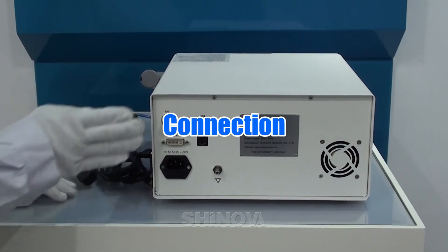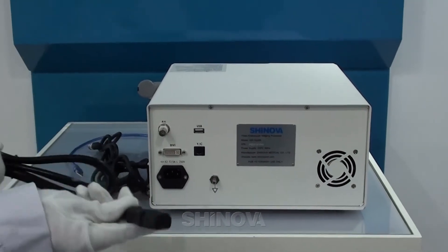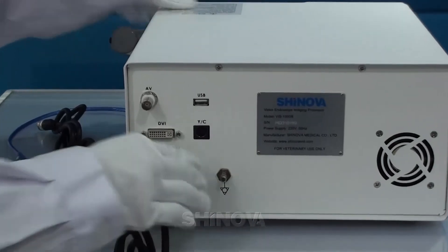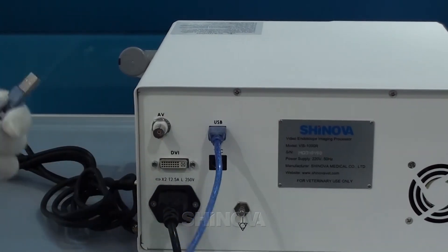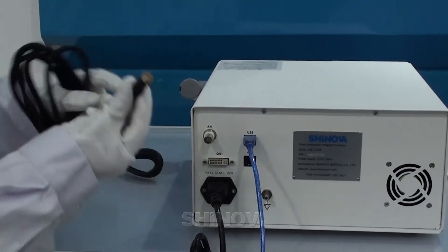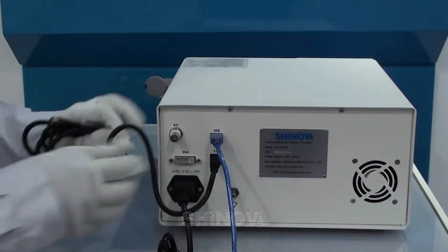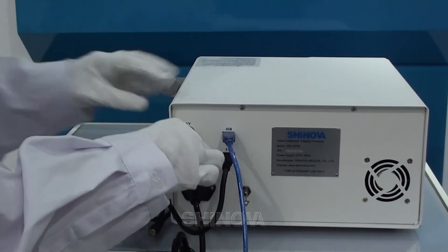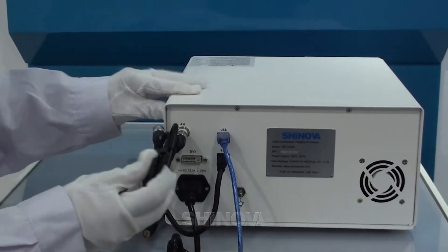Now I would like to introduce the backboard to you. You can connect the power cable here. Next is the USB cable from here to your computer. The third one is the YC cable, which can be connected here. The last one is the AV cable. That's all.